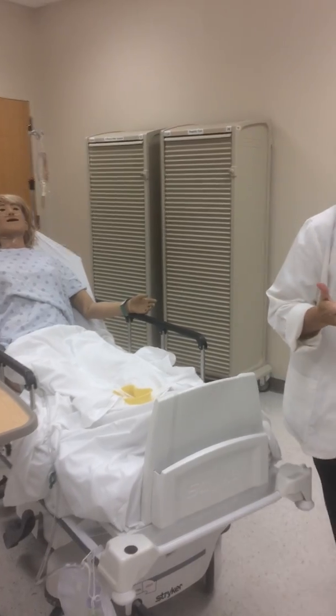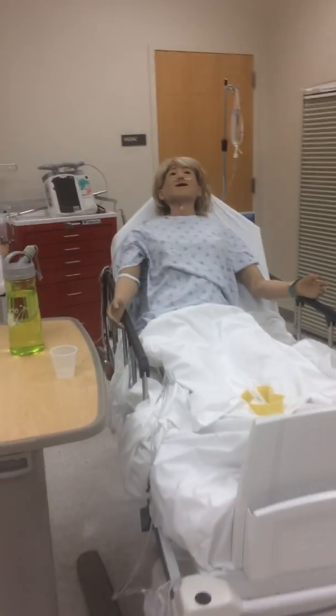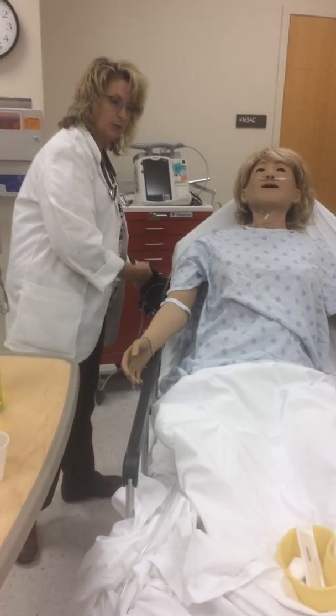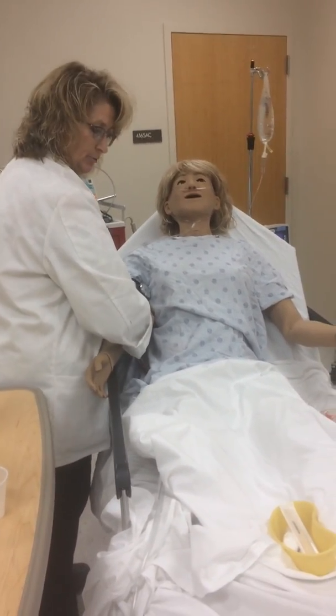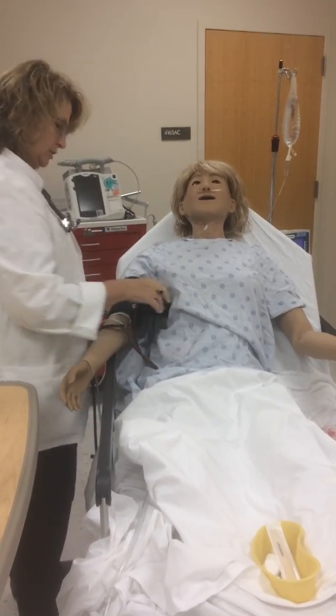The next thing I need to do is probably a set of vital signs. Vital signs, getting a good baseline is important. Although it's not part of your general survey, it's something that we can do while we're doing our general survey. So, Ms. Rivera, I'm going to go ahead and get a set of vital signs on you. I'll get a blood pressure, pulse, and respirations.